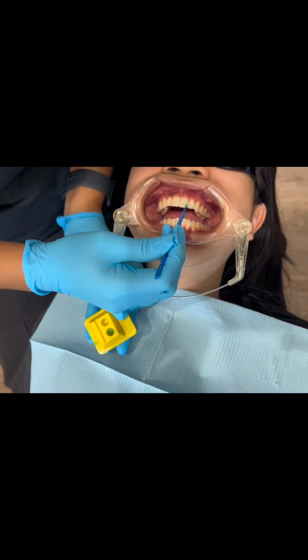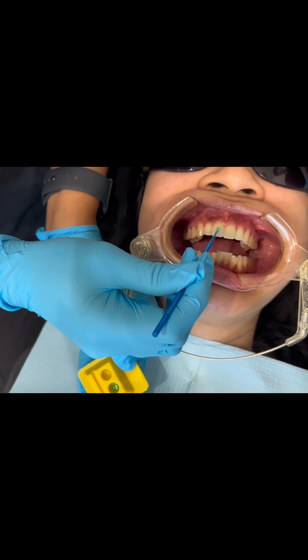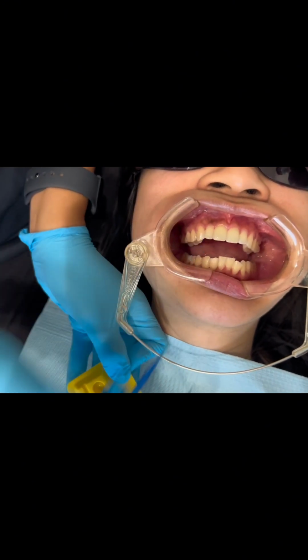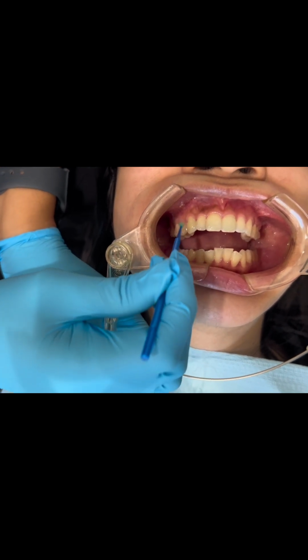So you see, I'm literally putting a little bit of edge on every tooth, literally like painting nails. Am I getting close to the gum line? No. We don't get close to the gum line, and we make sure we stay away from the lips.